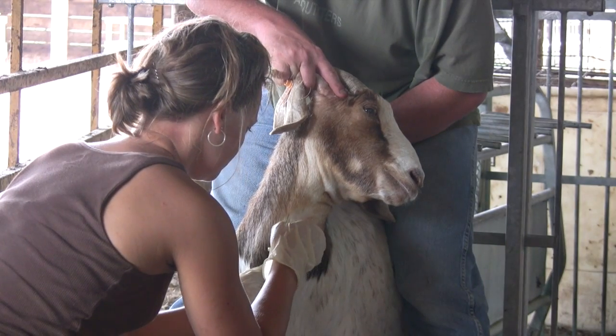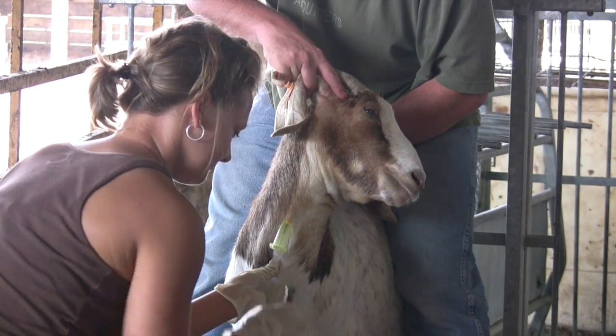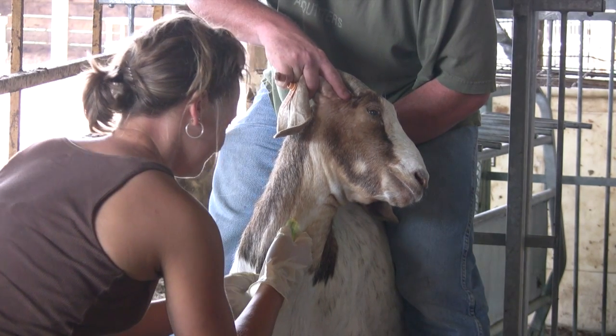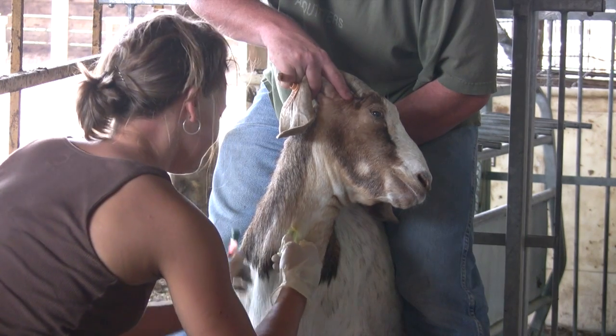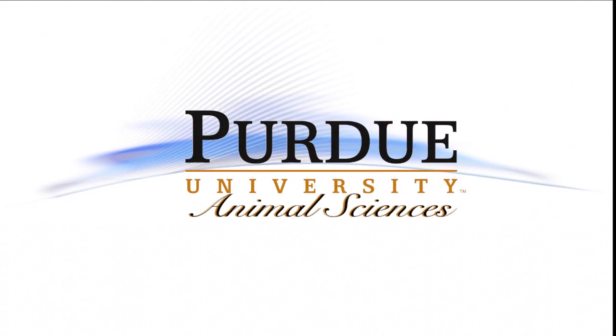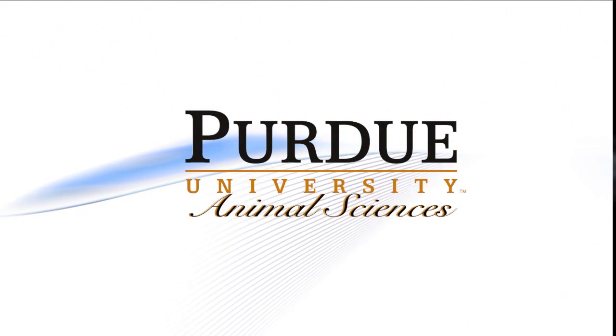Hopefully, this has given you a safe and easy way to collect blood on your small ruminants. Consulting a veterinarian or another producer who is experienced in drawing blood can help you learn this valuable management skill. This presentation was a production of the Animal Science Department at the Environmental Science Department at Purdue University.